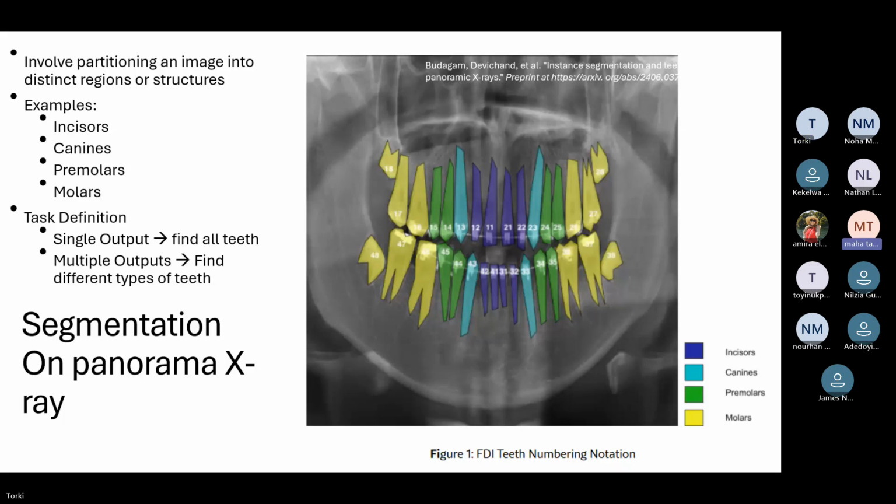Another question, can segmentation be used in low resources with low quality radiographs? Actually, most of the machine learning or deep learning algorithms do downsampling of the data, because processing one large volume of many voxels or even these images is very time consuming for the training, and we can get good results with small images such as 512 times 512.